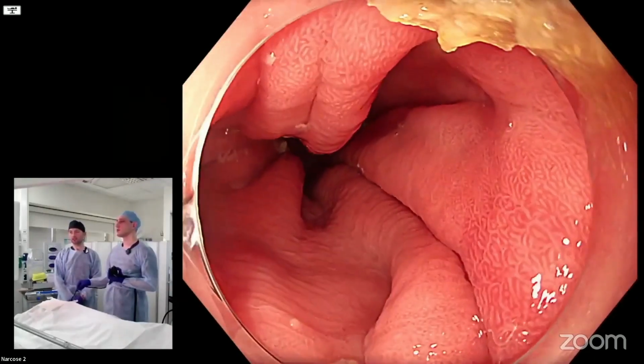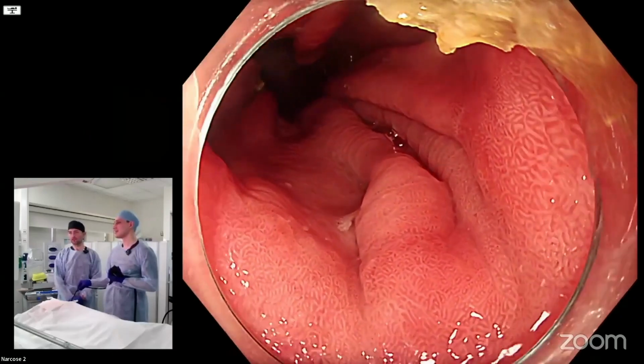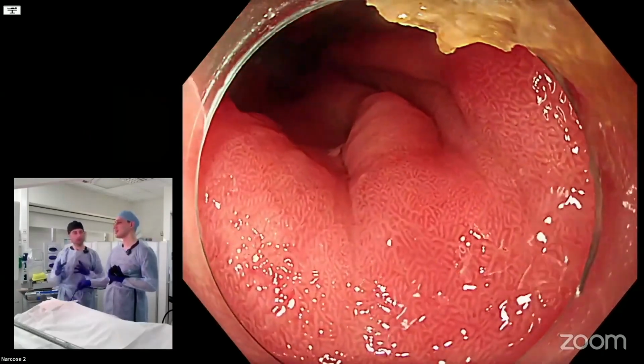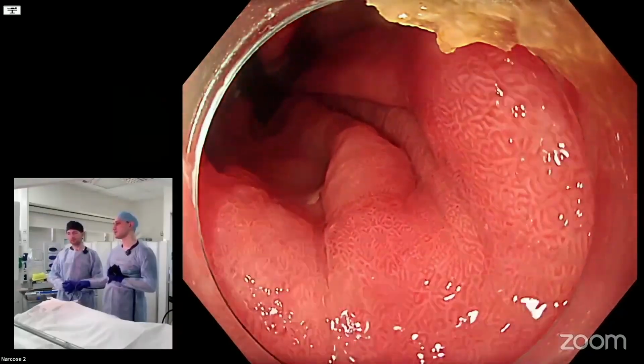So the top of the gastric folds is where you obviously described it. You no longer see gastric folds, but there are other appearances we know that come in that area. And what are they? Palisade vessels. Yes.